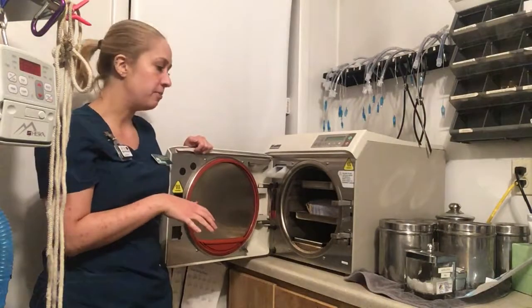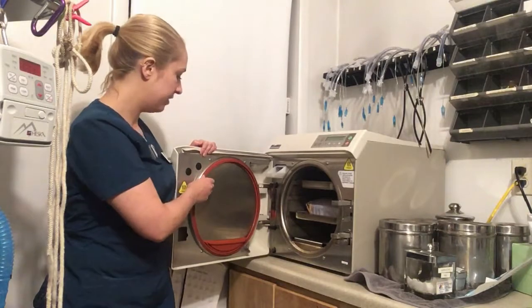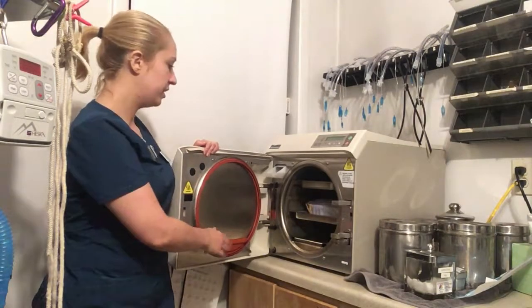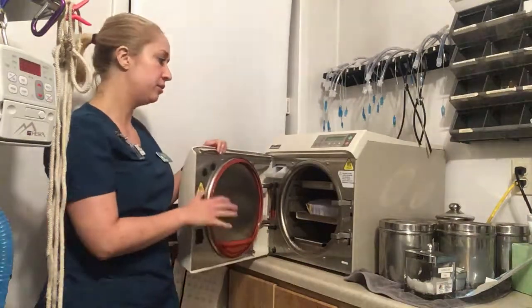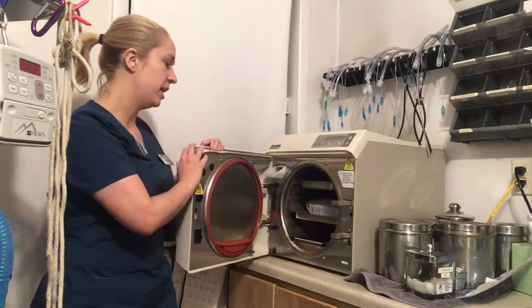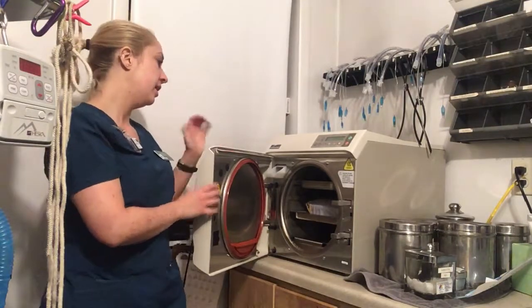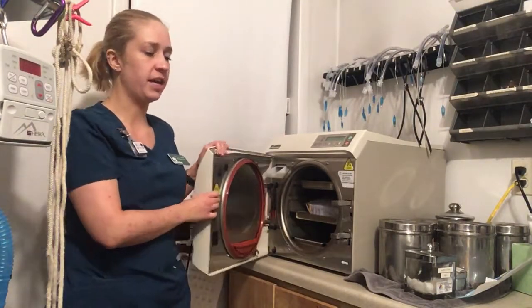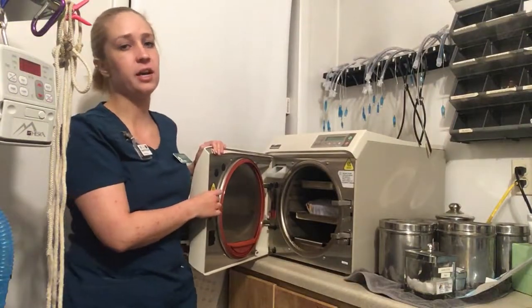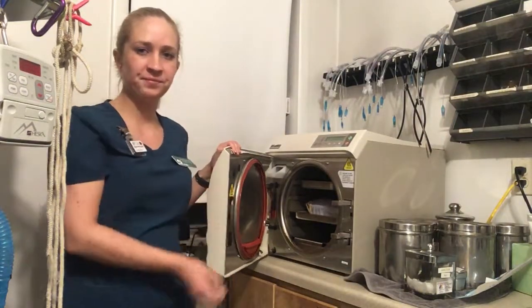It could damage the equipment. And if things start coming apart, or things don't stick the way that they used to, that could decrease the amount of pressure that's going on in the system, and that really could decrease the life of your autoclave, and also decrease the sterility of the packs that you're using.